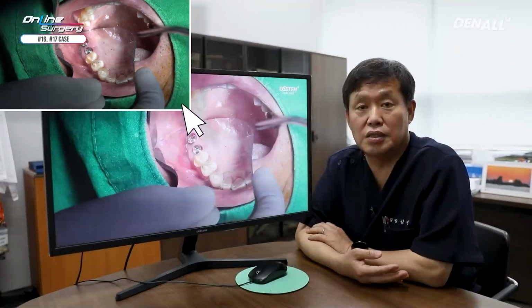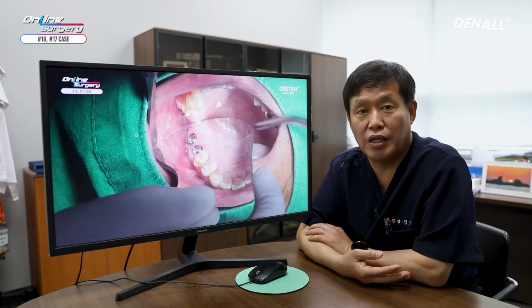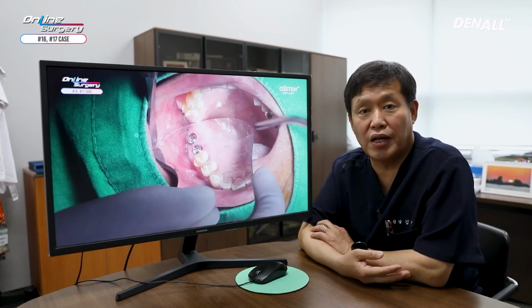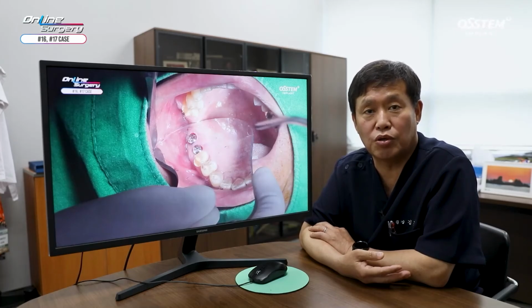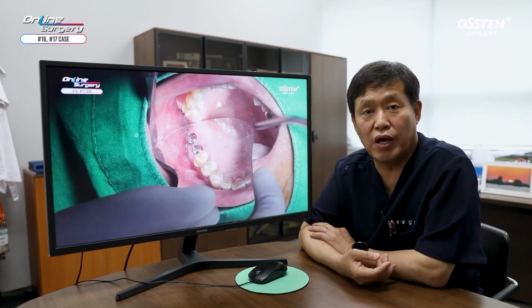In today's video, today's lecture centered around the question I received when placing a tapered TS3 implant when using the OneCAS drill. Because the drill is straight, people find it difficult to choose the final drill. Because it is upper posterior, you have to assume that it is soft bone. In order to place a 5 millimeter diameter implant, 3.8 is recommended. As for the OneCAS kit, because it comes in contact with the guide, it's difficult to get a tactile sense, so you need to have a 1.2 millimeter gap.